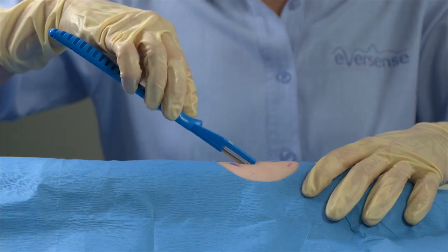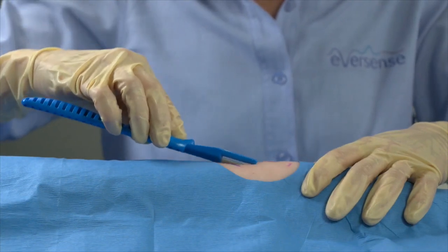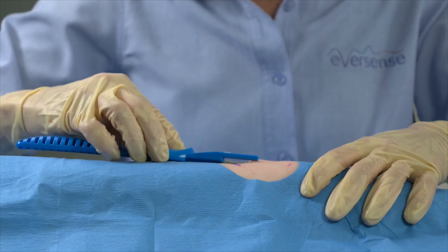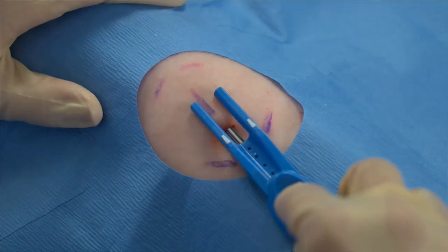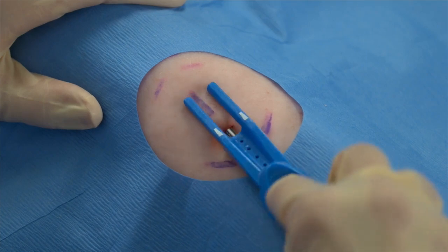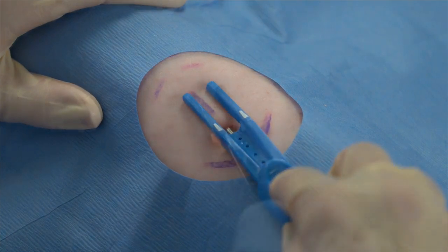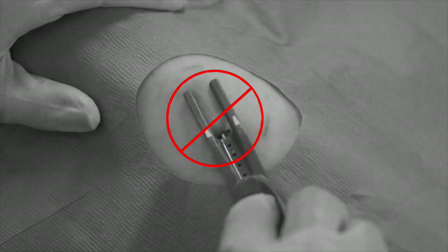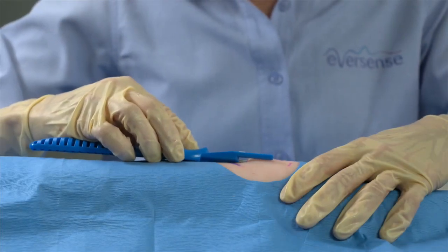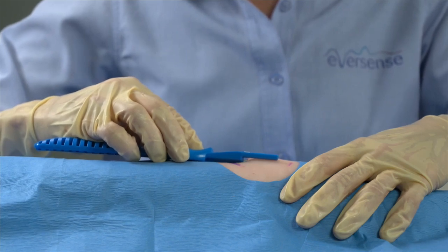Next, drop the angle of the tool flat to the skin. Keep your fingers on top of the blunt dissector. The depth guards should rest on the skin without any gap. Advance the blunt dissector its entire length. A slight amount of rotation around the center axis of the tool may be necessary to advance it, but don't fishtail with your hand as you advance the tool. You can re-advance the blunt dissector to ensure adequate pocket creation.